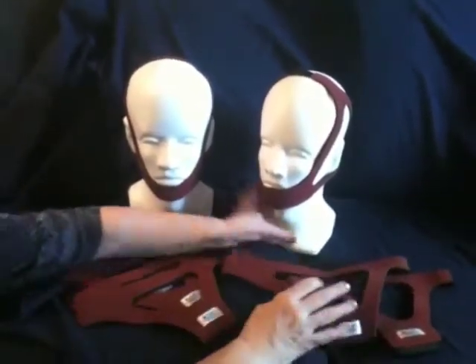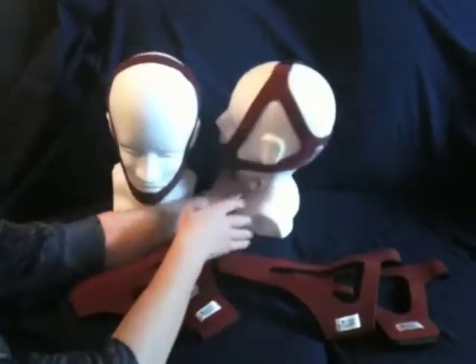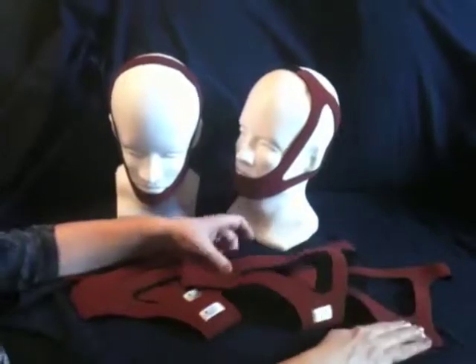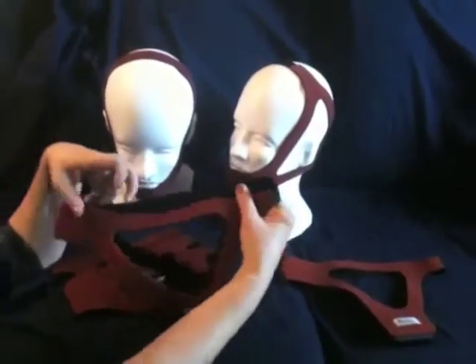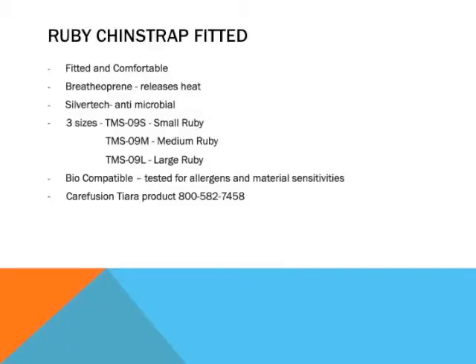It also comes in two adjustable styles, having Velcro tabs on the back of the head and the top of the head. It comes in large and extra large sizes to fit all patient head sizes, and always remember the tag goes in the back. I'd like to demonstrate fitting of the TMS-09 Fitted Chin Strap.